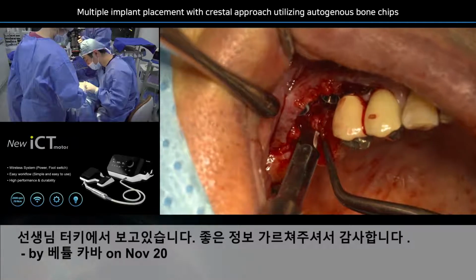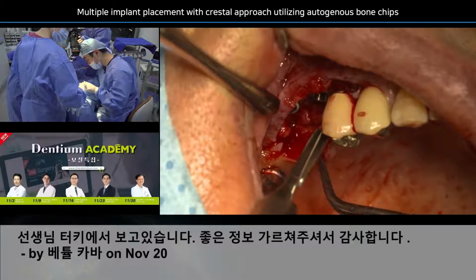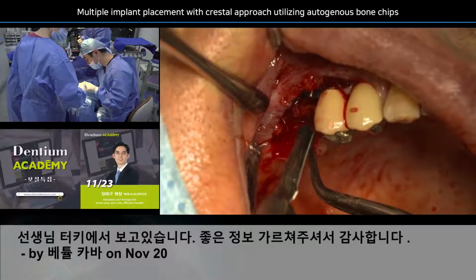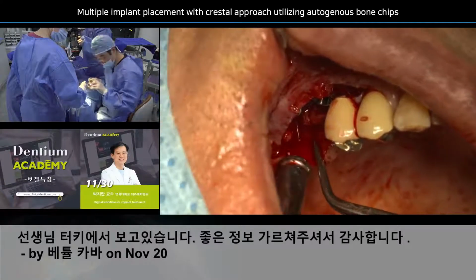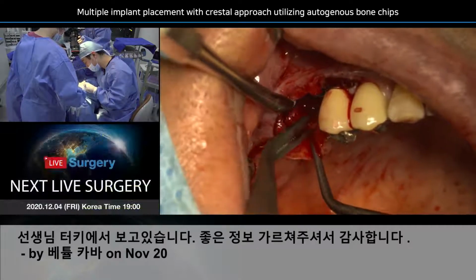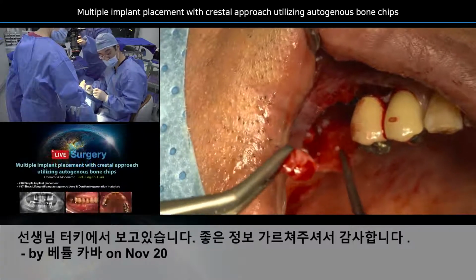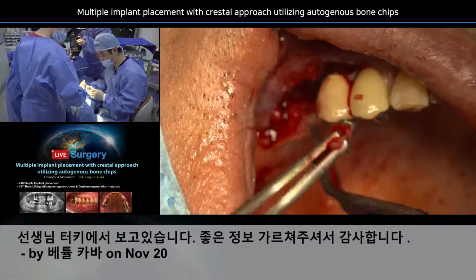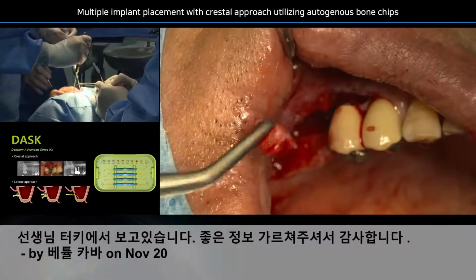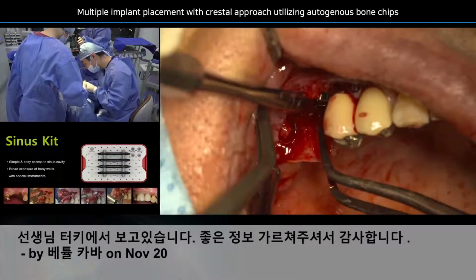So if I trim it using this blade, it gives me extra space. Do you see that I placed just the incision, and this amount of soft tissue will be removed, and I have further space for the proper GBR. So this amount of space I just created without any releasing incision. This is a very simple trick. Trim it and thin the palatal tissue. Then you will have much more space. So the releasing incision can be a little bit easier.